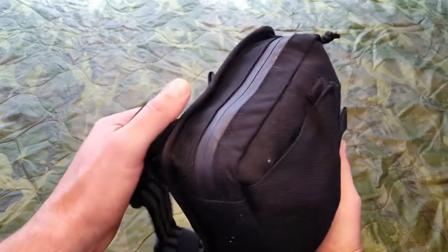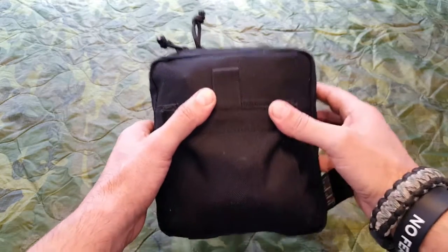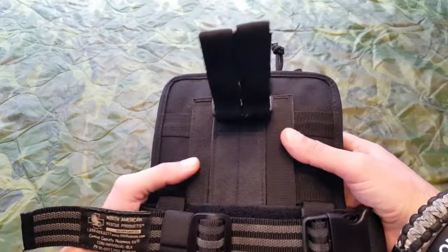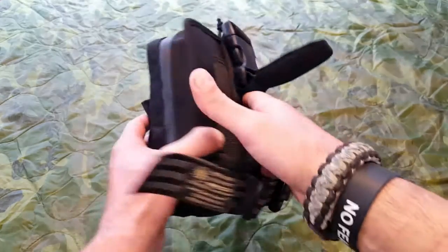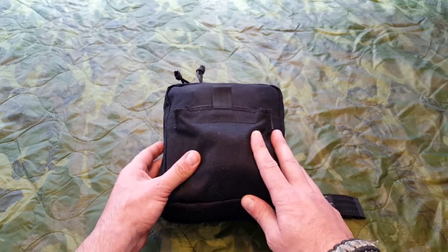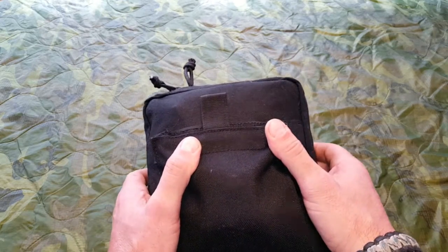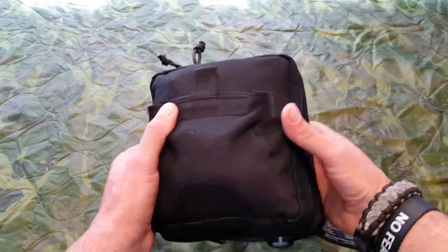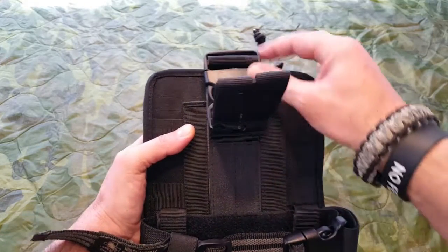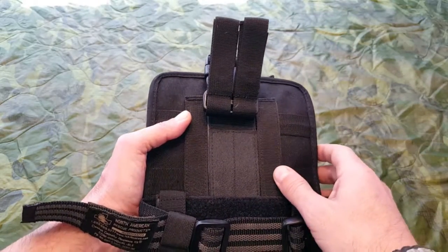Starting with the bag itself — you have the name recognition and the quality, so keep in mind you're going to pay for it. It's all about justifying whether this is right for you and your kit. This is a lot of standard issue for military combat medics, police SWAT, EMS, fire rescue, and first responders in general. So you could imagine this is not a toy. This isn't cheap knockoff stuff coming from overseas, specifically from China.